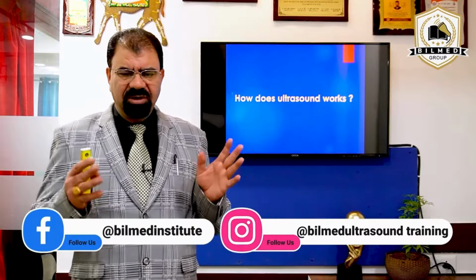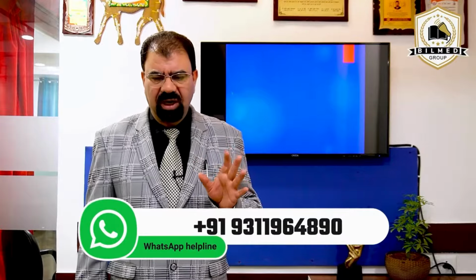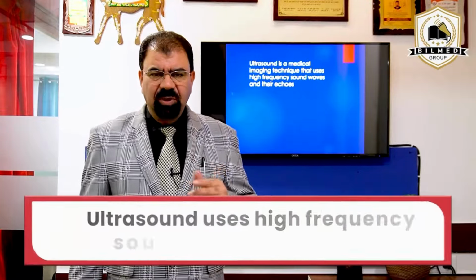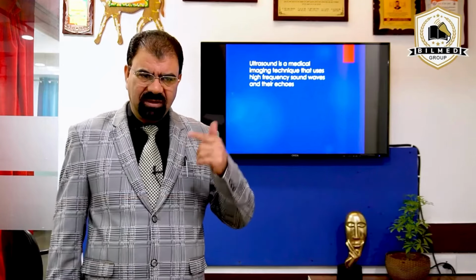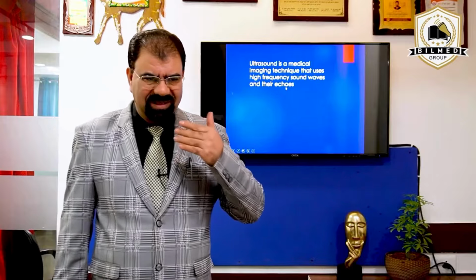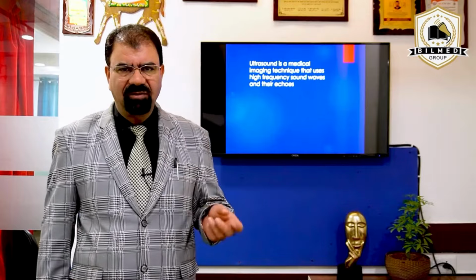Now how does an ultrasound work? We will now discuss in detail how ultrasound works. In medical imaging technology, we use high frequency sound waves and their echoes. We send sound waves and they bounce back from the target; that is the echo. Whatever we send, and whatever we get back or is reflected, that will be the echoes.